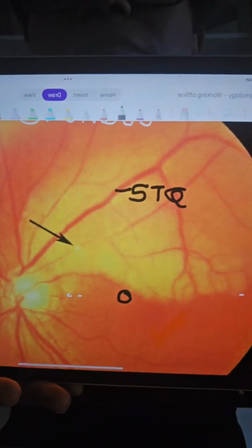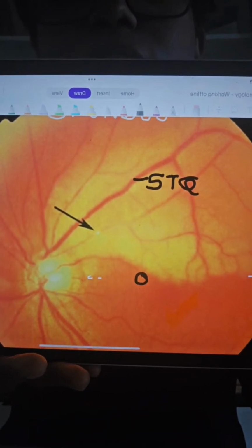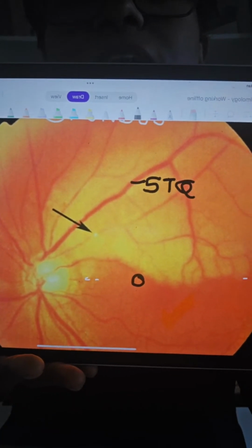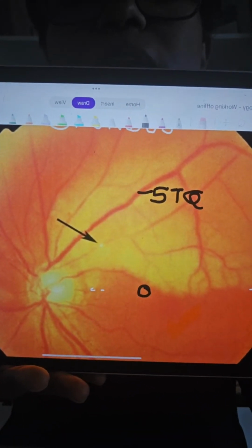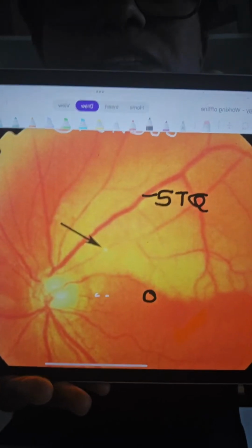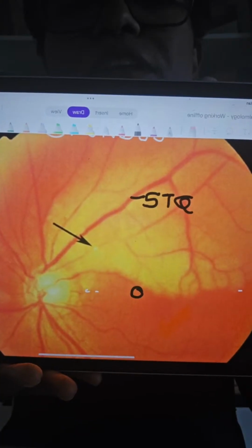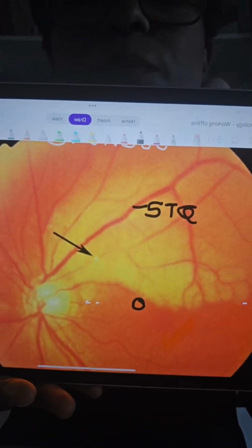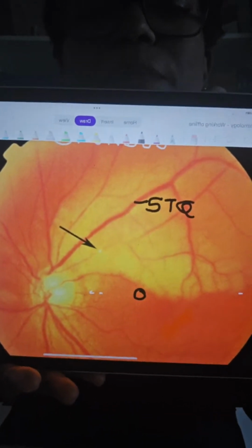So the area where I marked that little circle, that is your exact foveolar location. Foveola is not involved in that frosted appearance, in that white opacity, the opaque retina. So probably this patient's visual acuity itself will be normal, but he will complain of a visual field defect, which would be inferonasally only on the left eye. Right eye will be completely normal.